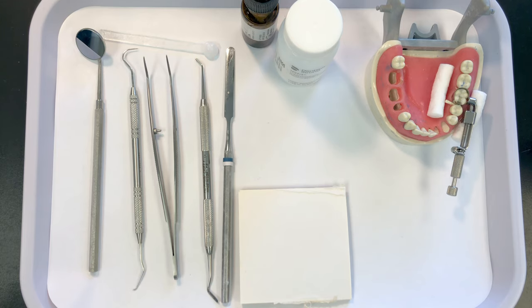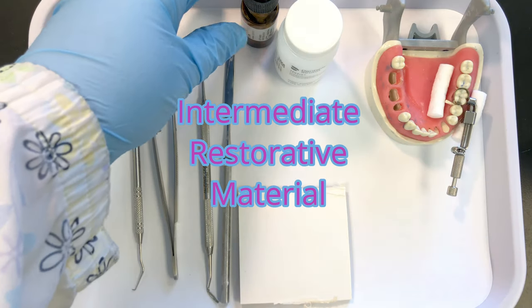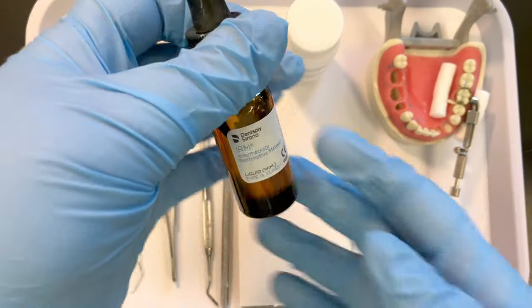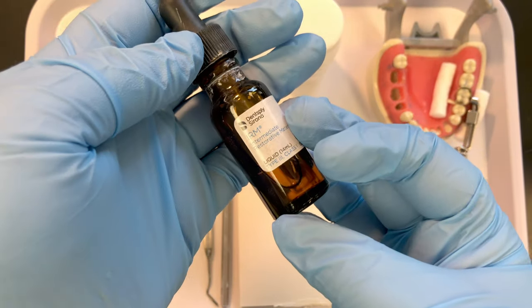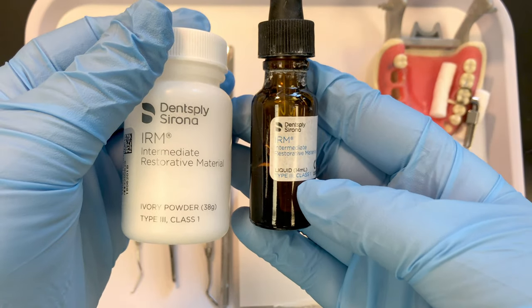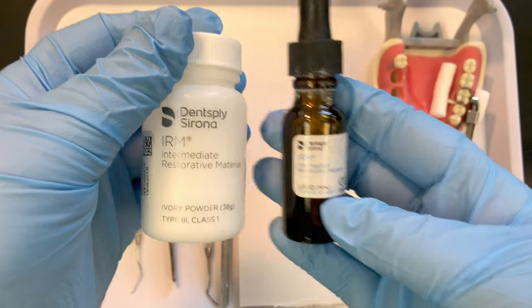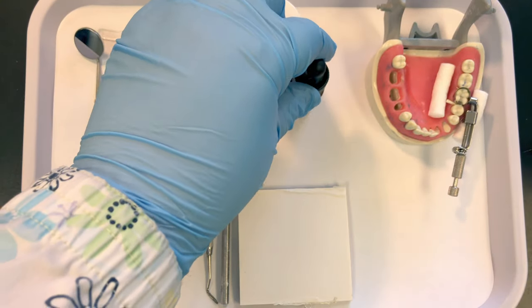Hi everyone, this video will demonstrate how to properly mix and place your IRM restorations. IRM stands for intermediate restorative material — it's a great way to temporarily fill or restore a tooth. It is a powder-liquid combination and it contains eugenol, which is made from clove oil.